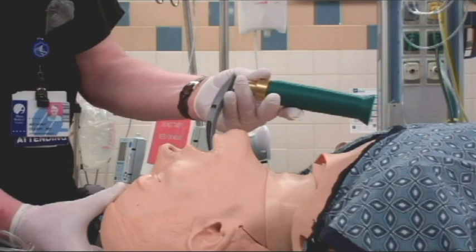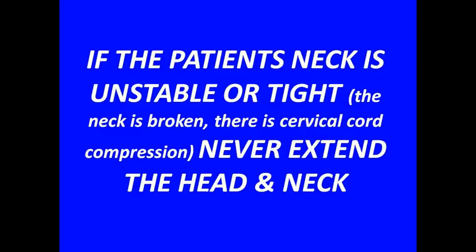We can now proceed to the mechanics of intubation. First, however, we will extend the patient's head on the neck, but only if it is safe to do so. In some patients, such as those with head and neck trauma or severe cervical spondylosis, it is most definitely not appropriate to move the neck at all. So the following only refers to patients with normal cervical vertebrae.